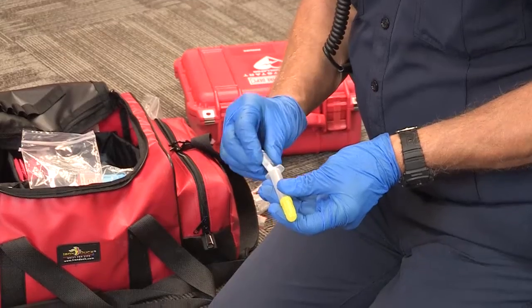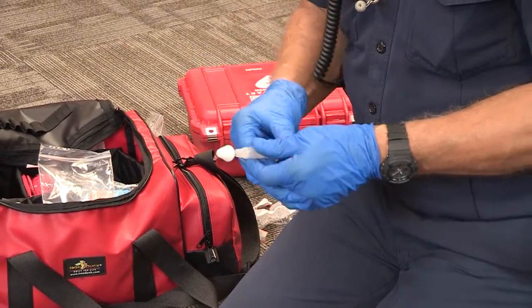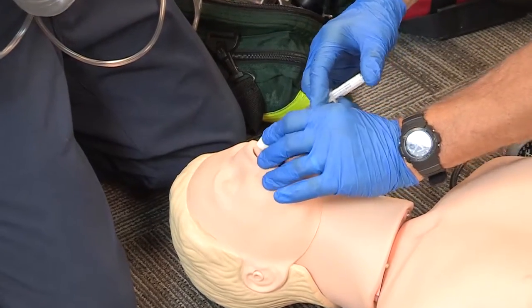Welcome to the skills video for the King County EMT administration of intranasal Narcan. My name is John Nolan. I'm a paramedic MSO with King County Medic One. We're going to show you how to assemble the preloaded syringe of Narcan and attach the MAD device, or mucosal atomization device. Then we're going to take you through a patient scenario and demonstrate the skill.